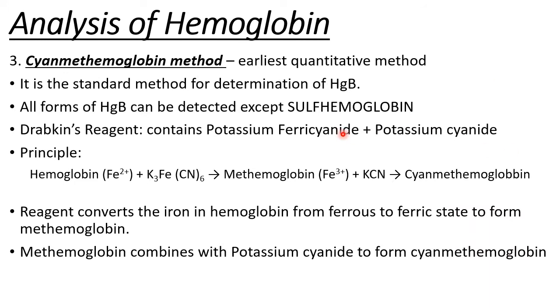Okay, the next hemoglobin determination is the earliest quantitative, no? Kaya niyang magbigay ng accurate level as in contrast with the early two analysis, no? Comparison lang by colors or colorimetric. Ito quantitative na tayo. Okay, this is the gold standard, no, which is being used in the machines. Ito yung principle din behind the ating mga automated machines.